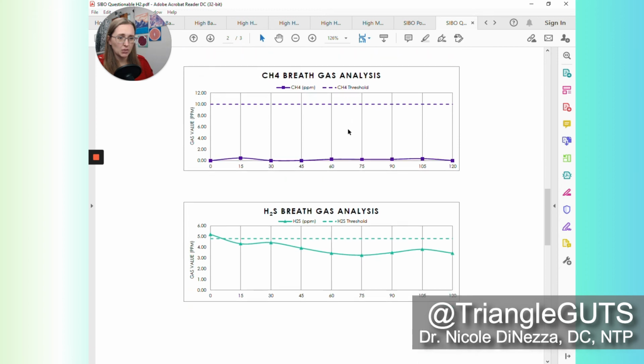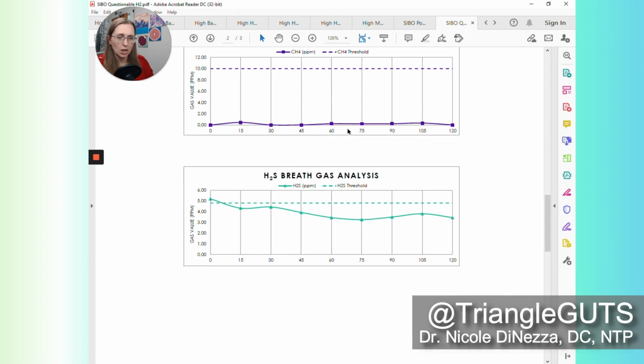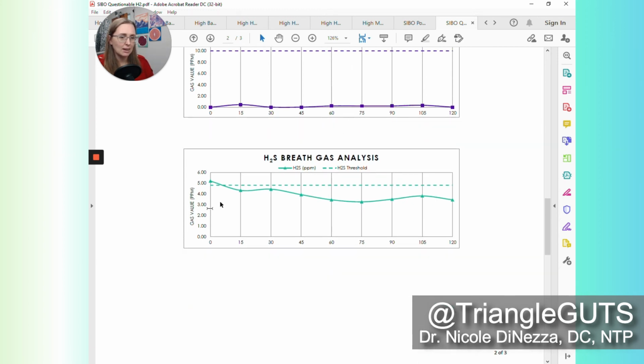Then let's go ahead and scroll down. Methane is nice and low. That's basically a flat line. And then yet again, we could see an elevated hydrogen sulfide baseline, and then it gradually goes down over time, but it stays pretty elevated. It goes only from about 5 to maybe like 3.75 at the end. So this is, again, I would say, hydrogen sulfide colonic dysbiosis more than likely, or maybe oral dysbiosis.